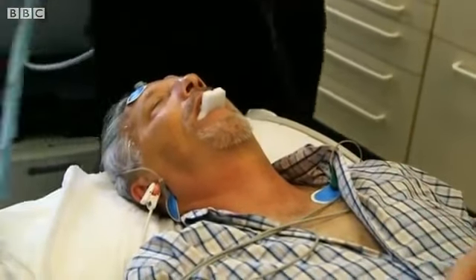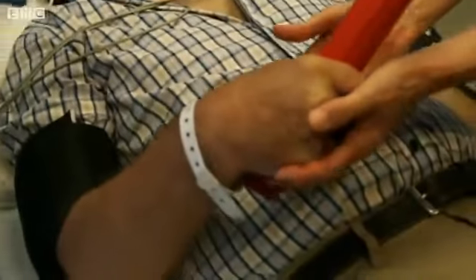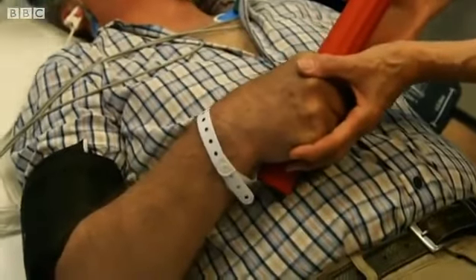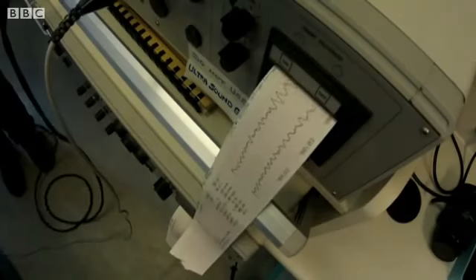You saw there that initially John grimaced — not because he was in pain, but because we were stimulating the muscles around his face directly with the electricity. And then after that, we could see from the EEG that a seizure had been induced.